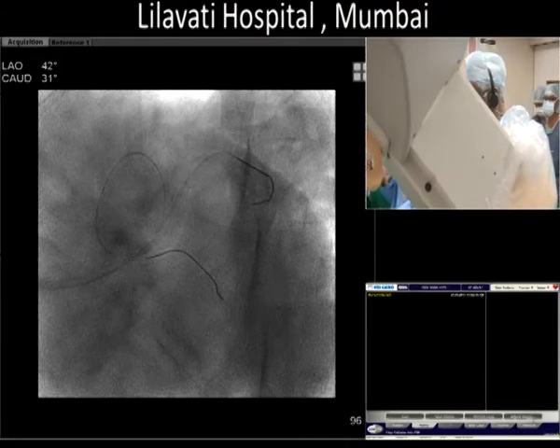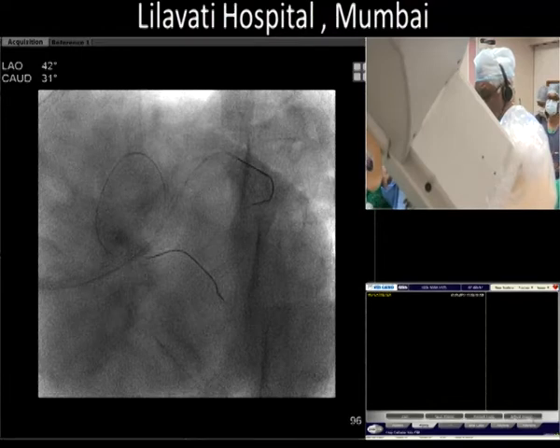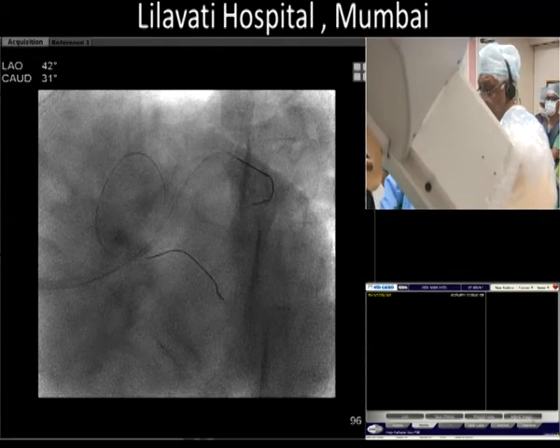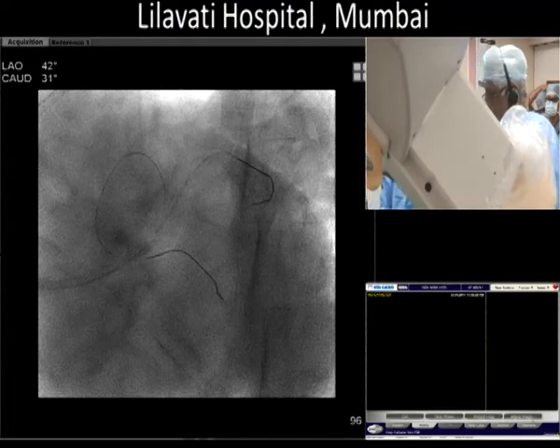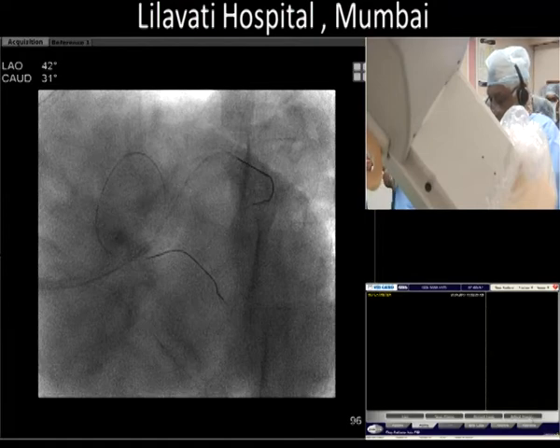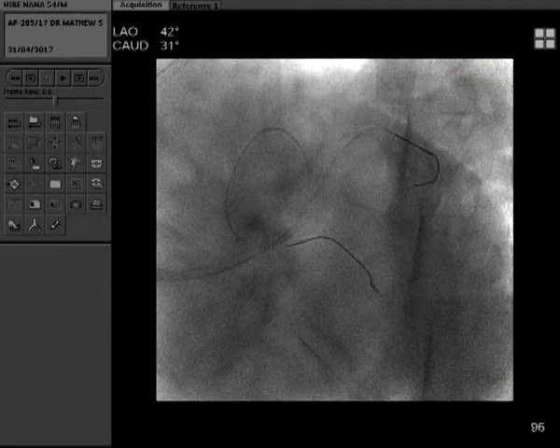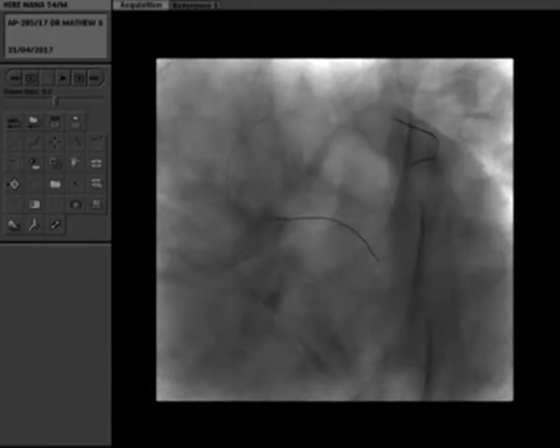I generally don't believe in multiple dilatation. I don't think it makes any difference unless you go to higher pressures. When you deliver a stent, you can go to the optimal pressure and deliver it. And as Manish said, slightly higher pressure, 14, 15 minimum, and going up to 18 is fair. That's what I generally do. And always at least 1-to-1 size.